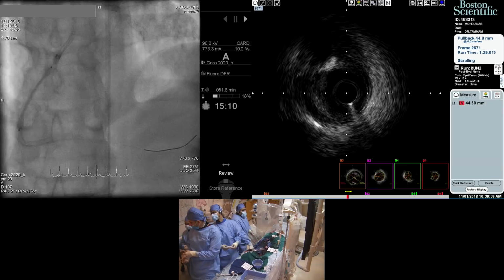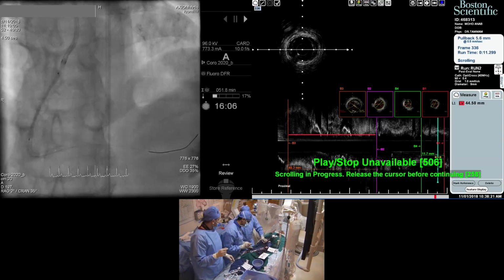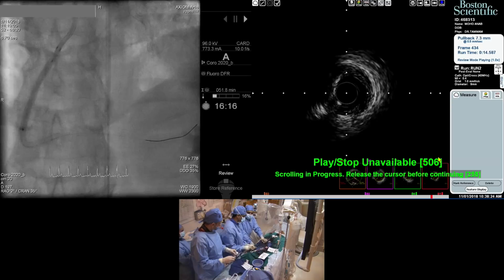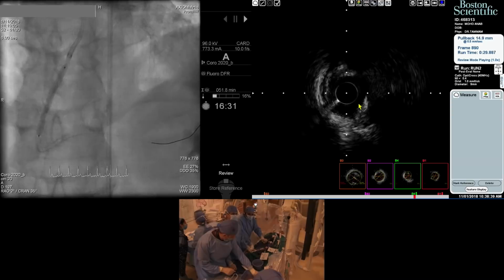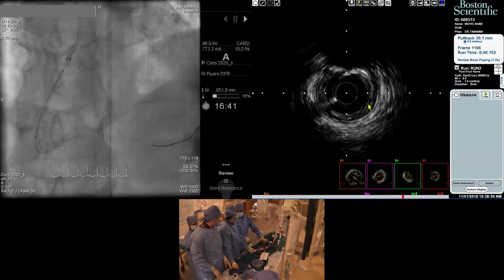Make it 18. Do you have 18? Yes, on screen. So you have a couple of measurements on the longitudinal pullback. At the same time, we are starting the pullback from the very distal right. So this is where we are distal to the crux, and you see that at this level there is some plaque, but the disease is not major and could be left like this. We are coming to the crux just at this level, and you saw that the plaque burden is in the order of 50%, but all this segment here is acceptable.